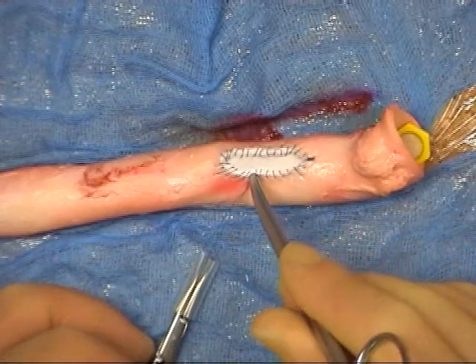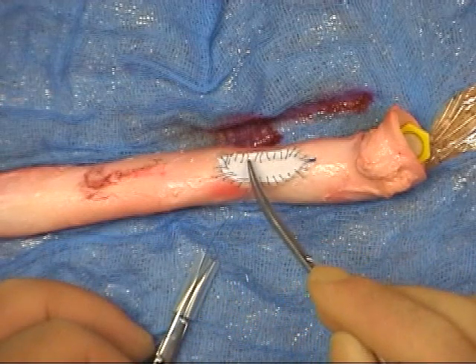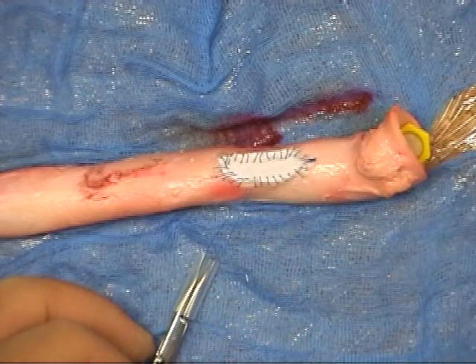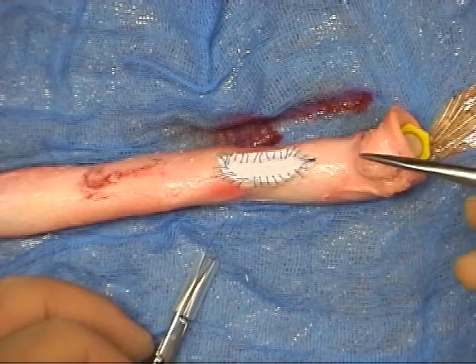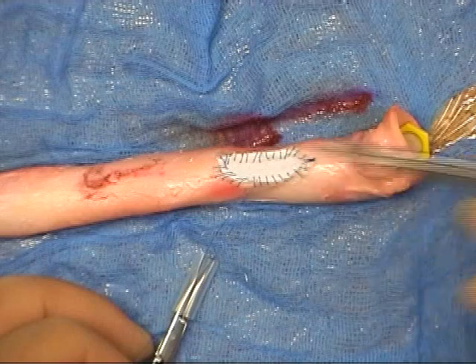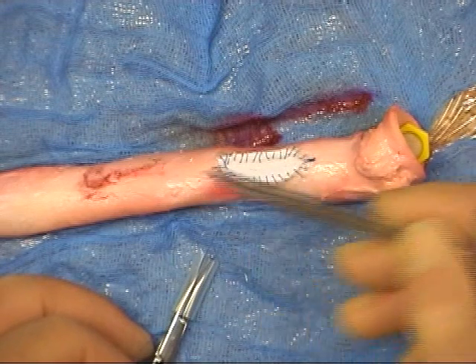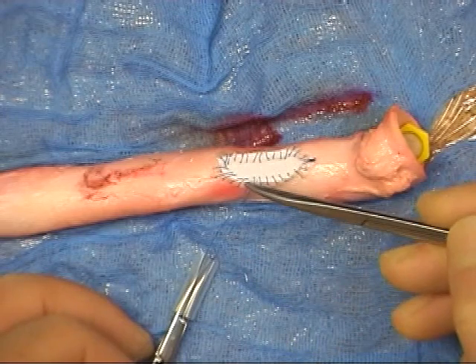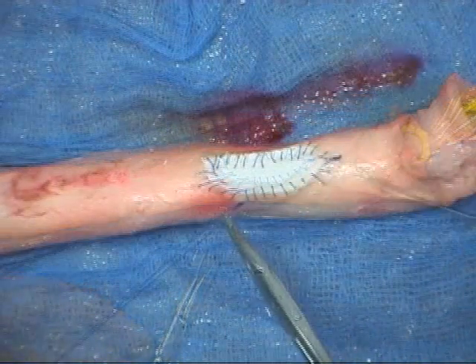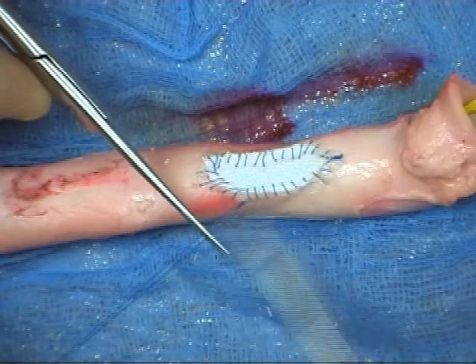Before the final bite is placed, the small opening is inspected for back bleeding from the distal end of the vessel. Any thrombus that has formed is expelled from the proximal end, and heparinised saline is flushed through the distal end. The vessel is then reclamped, as the final bite is placed through the graft and vessel wall.